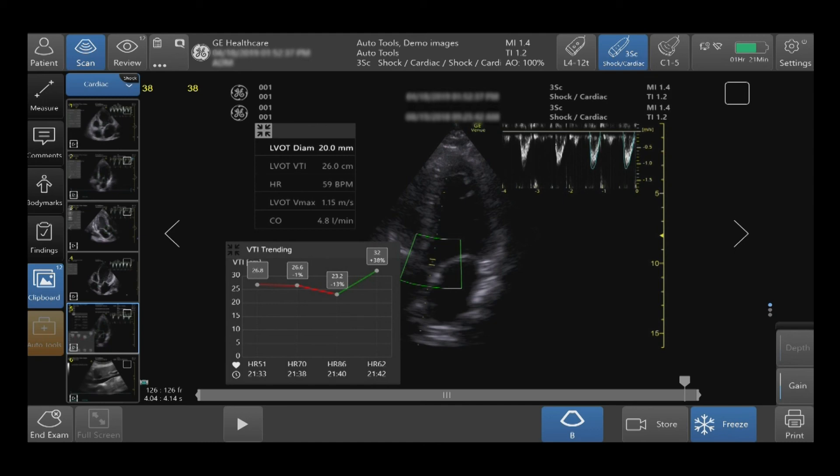To activate VTI Trending, tap on your auto tools in the bottom left hand side of your touch screen and tap VTI Trending. You will see this option while scanning live.